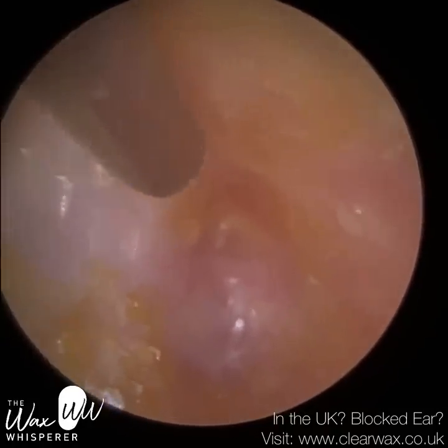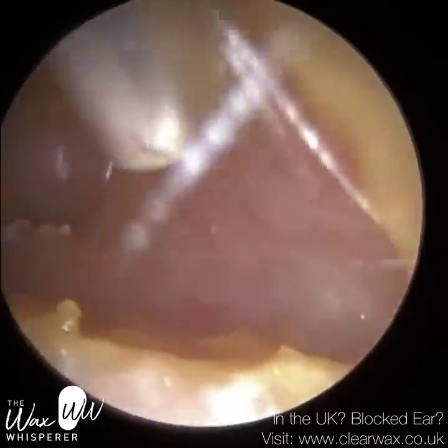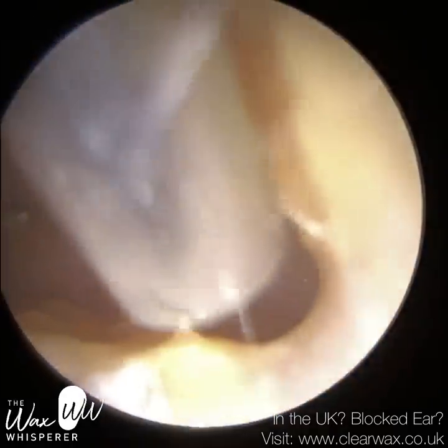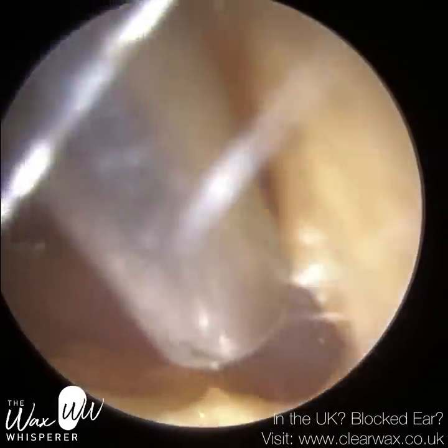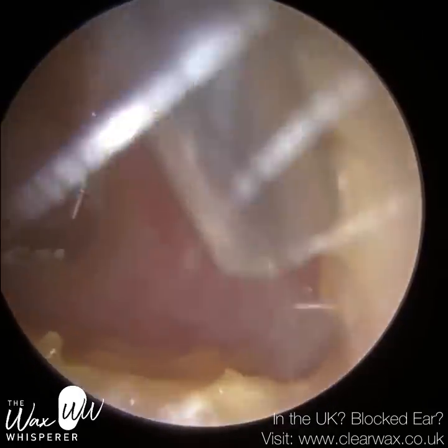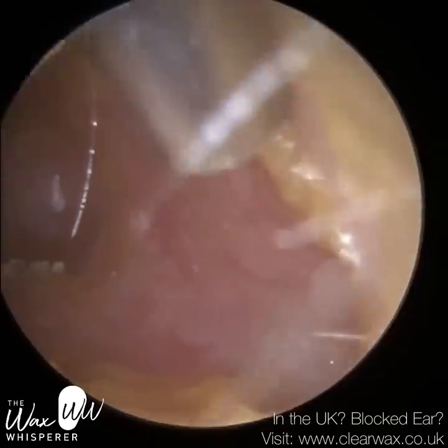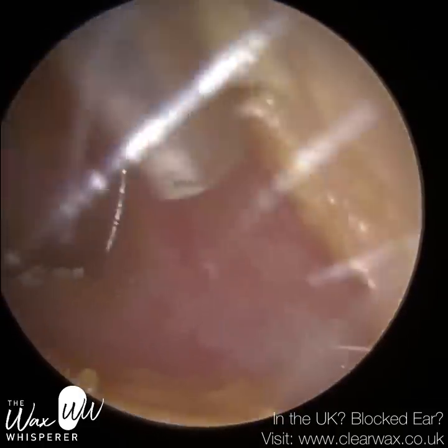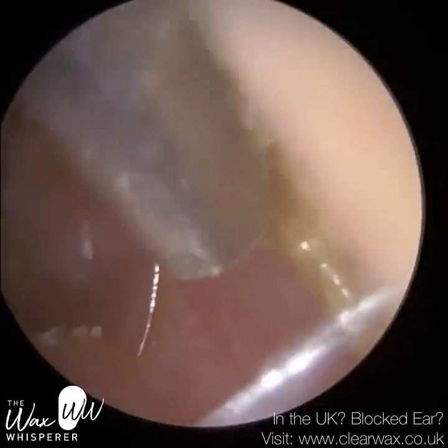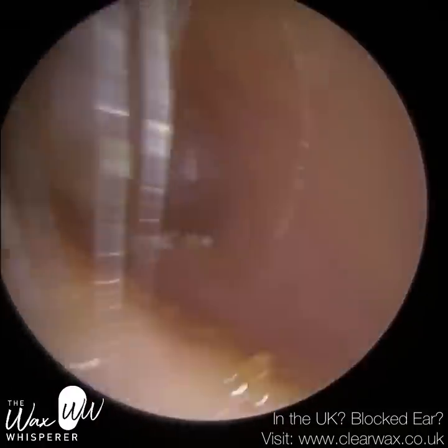So if this patient were to have a CT scan, comparing the length of this ear canal to their opposite ear canal, the length of this ear canal will be significantly shorter, because the medial part of the ear canal towards the eardrum has been filled in by all this fibrous tissue, reducing the length of the ear canal. So they have a shorter ear canal length for that reason. So more at the entrance here, you can see there's some dead sticky skin. I'm just going to try and peel that away.